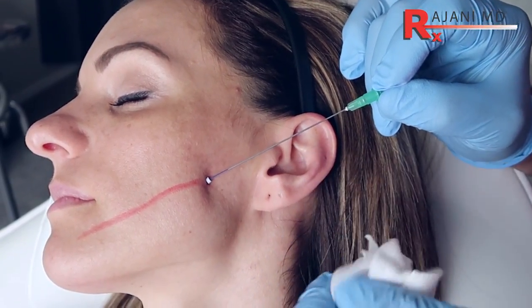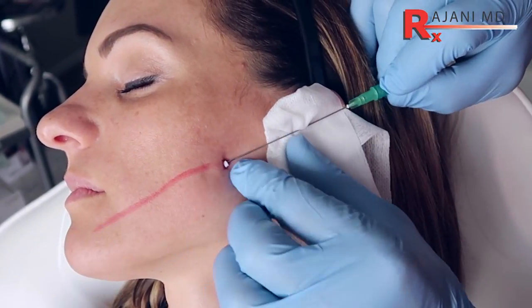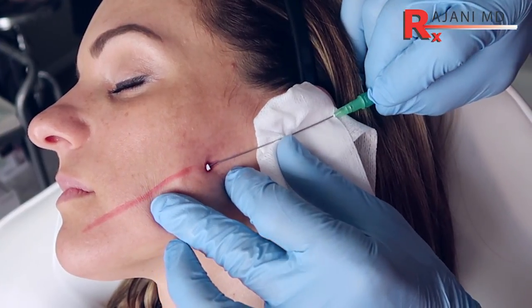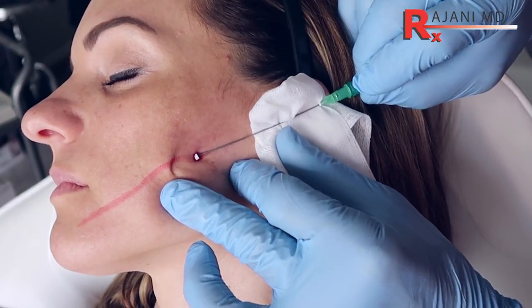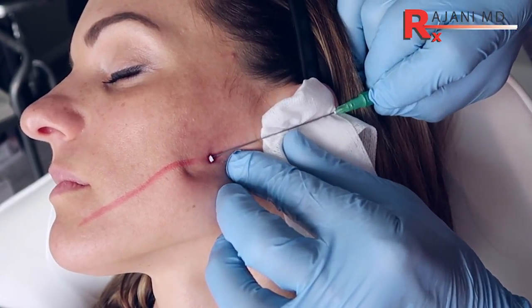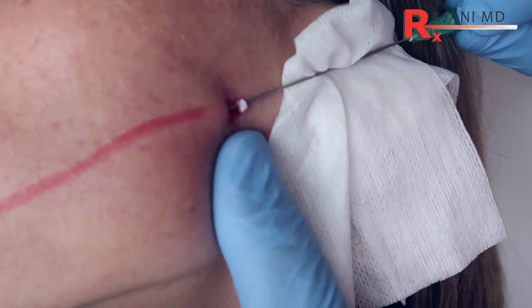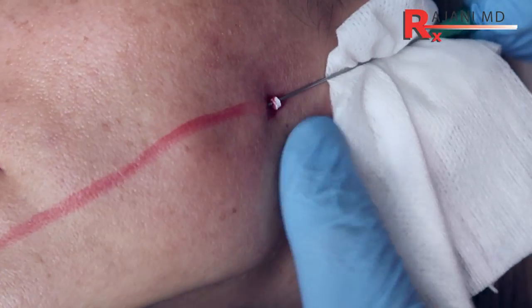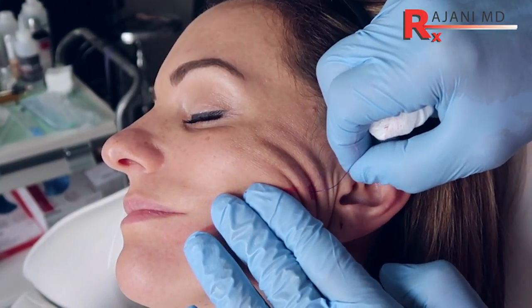You can watch videos of these being done, but the depth is one of the most important things — figuring out the vector, which is different for many people depending on your consult. Putting the cannula tip on an upward trajectory is what really helps get that correct plane, not too deep and not too superficial. The tensile strength of the thread really plays a role, and that's developed over time so that you don't get the puckering or some of those side effects. It's a very smooth application.